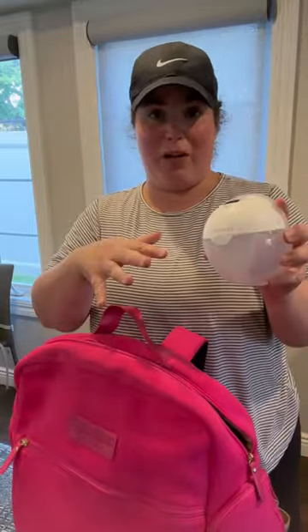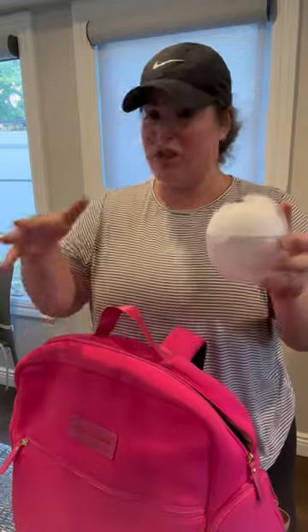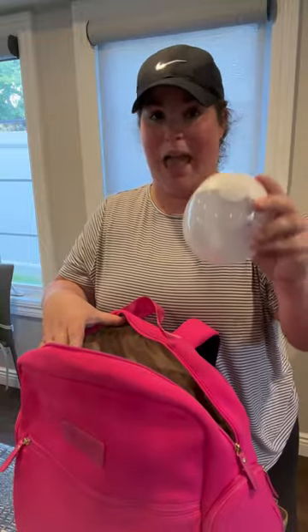If I'm going somewhere or I just like to have it, you can keep a wearable in your pump bag as well. But remember that I don't suggest using a wearable pump more than two times a day. So if you want to have it as an extra, go ahead and stick that in too. This is the Mom Cozy M5.